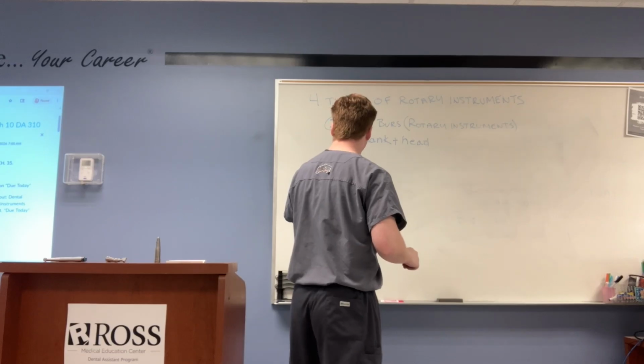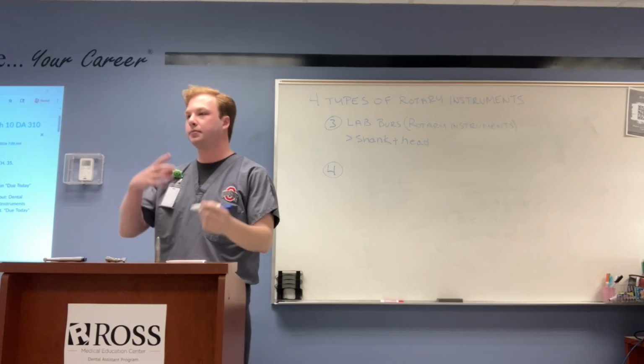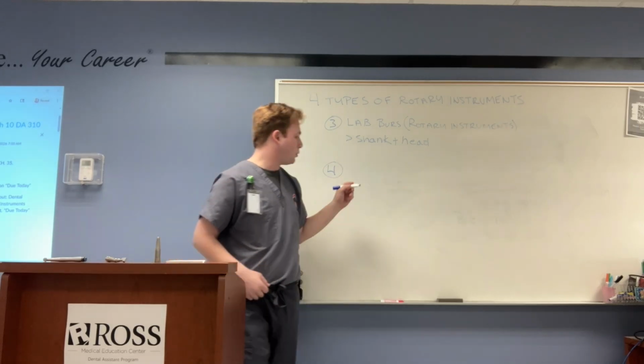So number 4, the fourth and final type, well, not final type, there are dozens of specialty ones that you can get in the nitty-gritty, but these are the ones that I want you to know. We have abrasive.